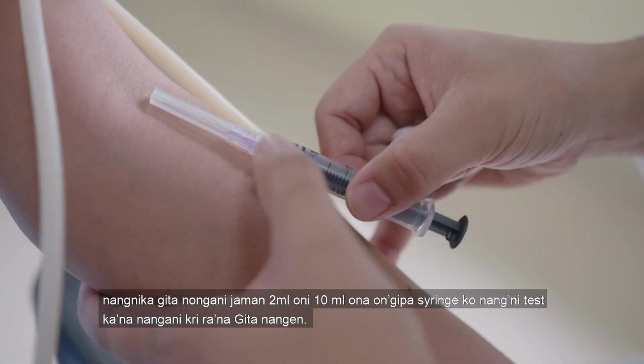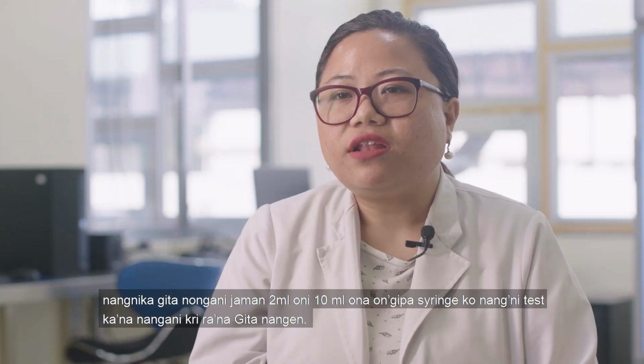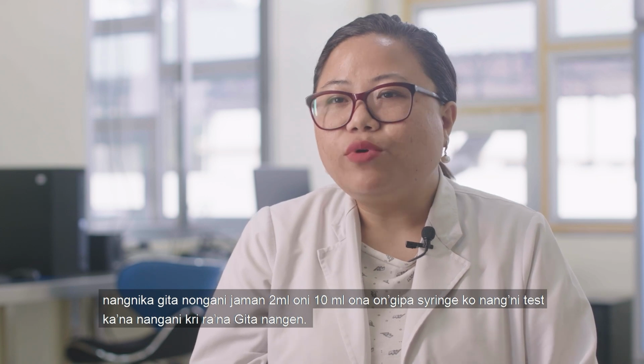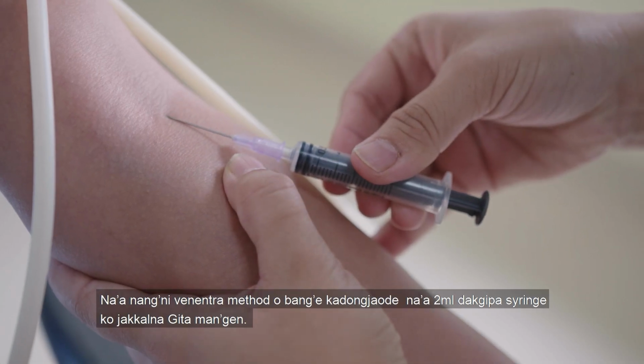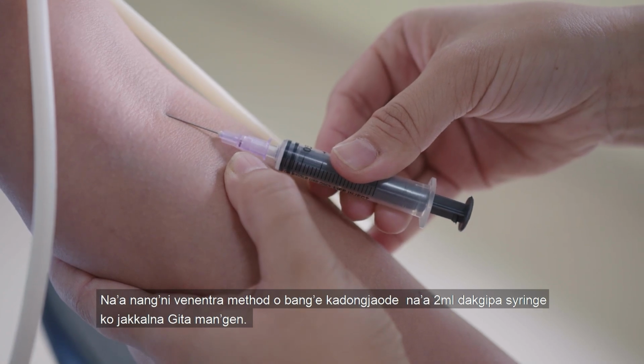And take a syringe, 2 ml to 10 ml depending on the number of tests that you're going to perform. Most preferably and most comfortably, if you are not confident in your venipuncture method, you can use a 2 ml syringe.